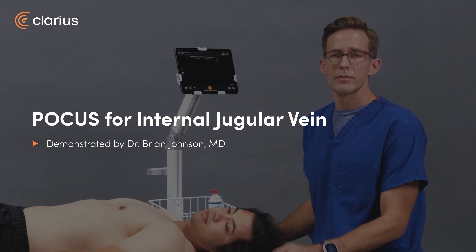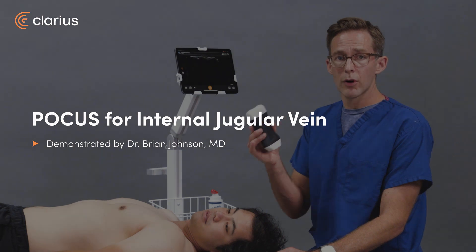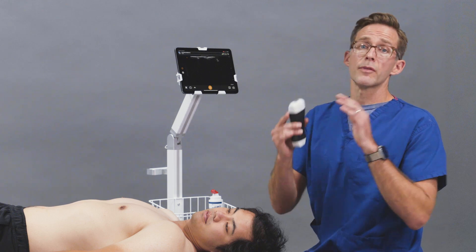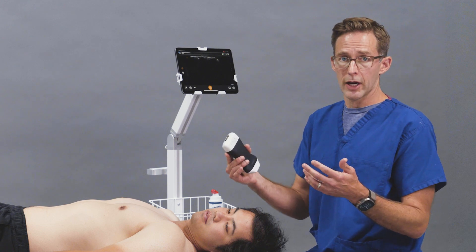Hello, I'm Brian Johnson. I'm an emergency room physician, and today we're going to use the Clarius Pal probe to look at the internal jugular vein for central line access. We're not going to perform a central line today, but what we're going to do is identify the sonographic landmarks for a central line.